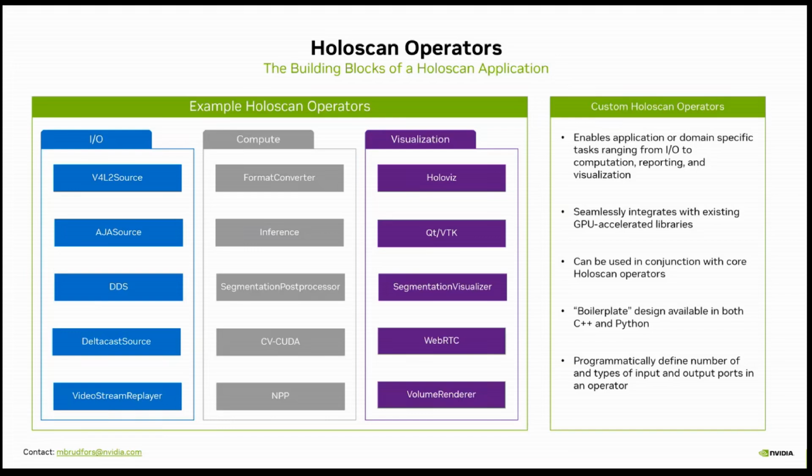Visualization is done with HoloViz, and that is written with Vulkan. It has a nice feature of being able to render onto the screen from a GPU buffer. So this means that with Holoscan and one of these IGX platforms, you can take data onto the device, pass it directly into GPU memory, and do all your compute and your rendering, never leaving the GPU, not having the CPU involved at all. And that's what enables very performant applications.